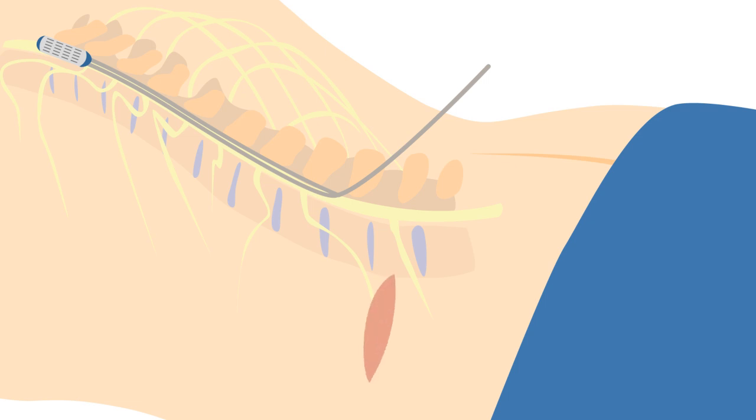Once those are in place, a second incision is made to subcutaneously place the implantable pulse generator, which includes the battery. Usually, this is right above the buttocks or in the abdomen. The leads are connected to the generator, and then the wounds are closed.